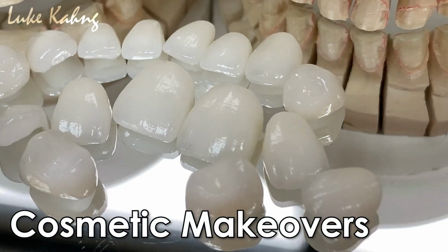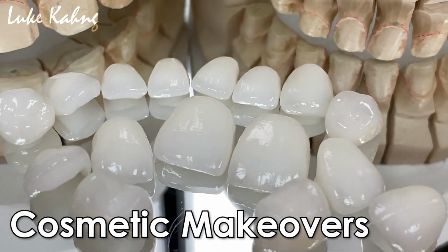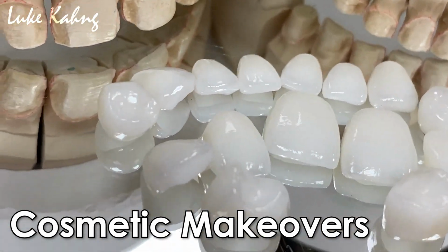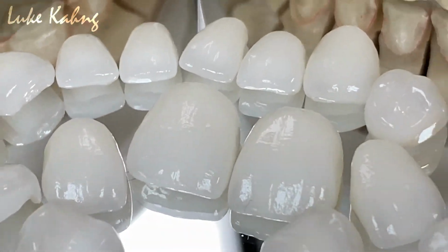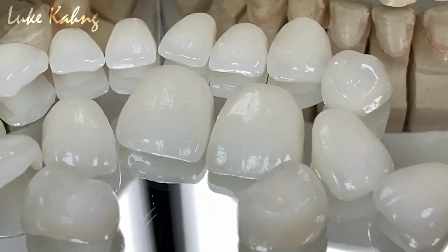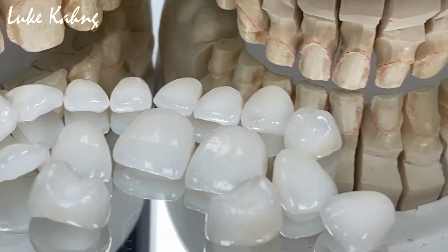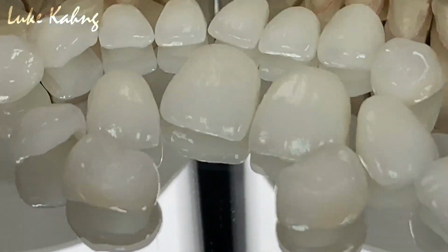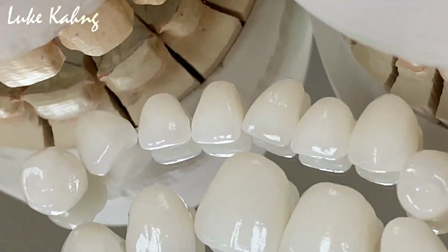Okay, so this is the 16 unit case, from the premolars crown, and the lateral and central veneers, with a great amount of surface texture and great preparations. This is a mirror image, so you can see more detail about the final work.